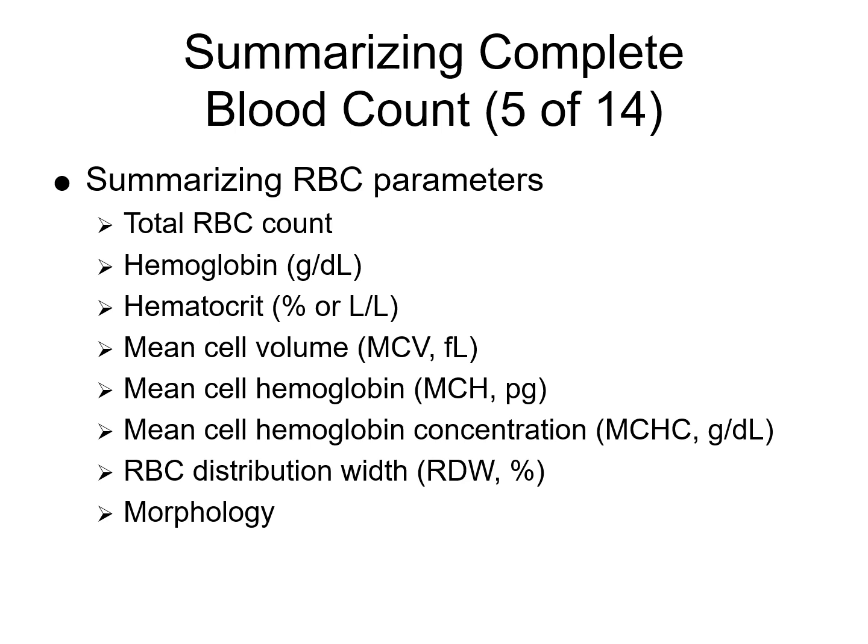The MCV, or the mean cell volume, is the average volume of individual red blood cells used to classify anemias as microcytic, normocytic, or macrocytic. The mean cell hemoglobin, or MCH, is the average amount of hemoglobin per red blood cell. MCHC, or the mean cell hemoglobin concentration, is the average concentration of hemoglobin in a given volume of packed red blood cells.